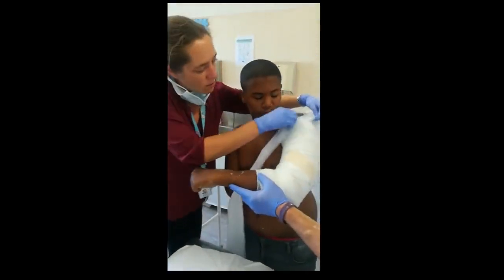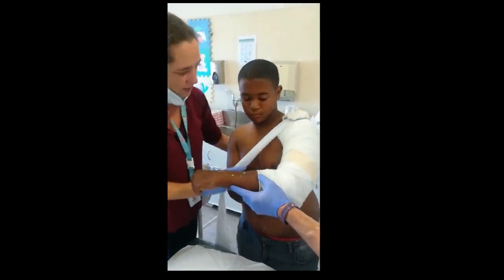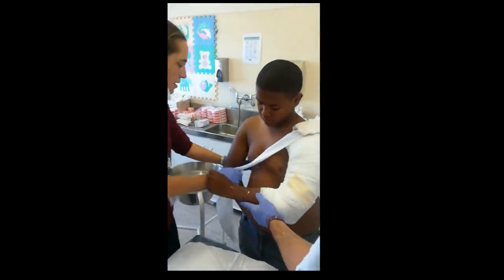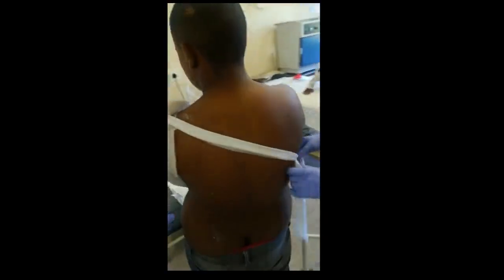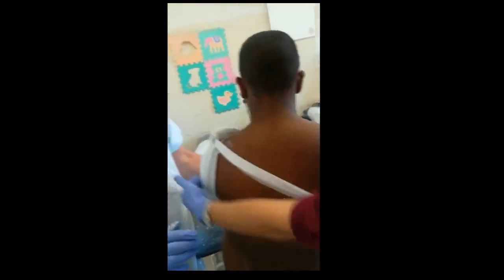So you take your sling — you can use flannel or the usual collar and cuff that you find in your casualty department. Drop the arm to the bottom and use the sling underneath the patient's opposite axilla like this. The purpose of this sling is to stop your cast from falling down the arm. That's your first sling.